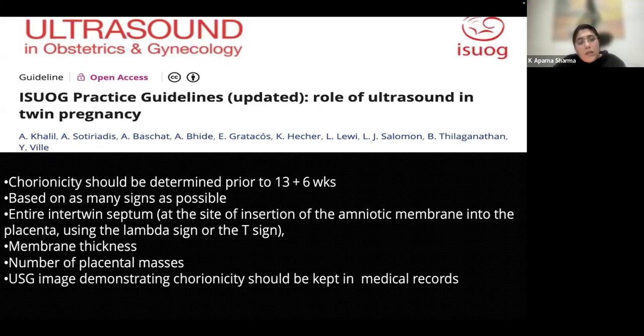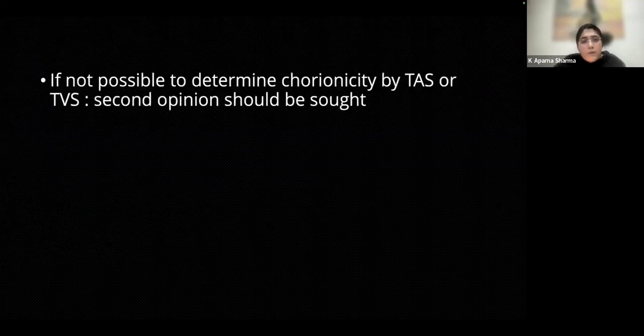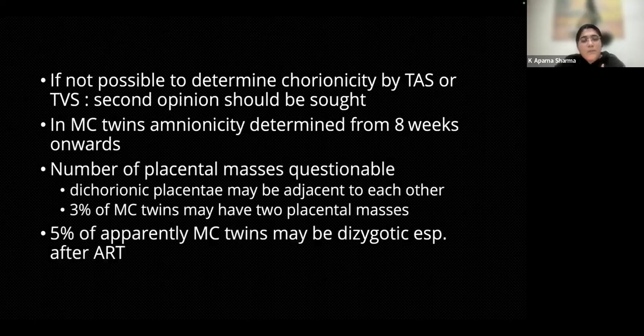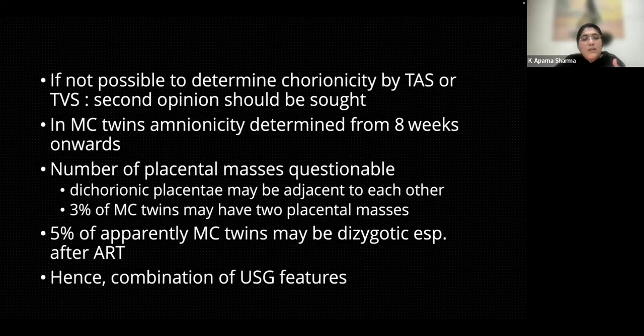So we need to examine the septum from the origin to the bottom, the top, for the entire septum. That is extremely important, because increasingly we realize that monochorionic and dichorionic are not just black and white. There are some grays.